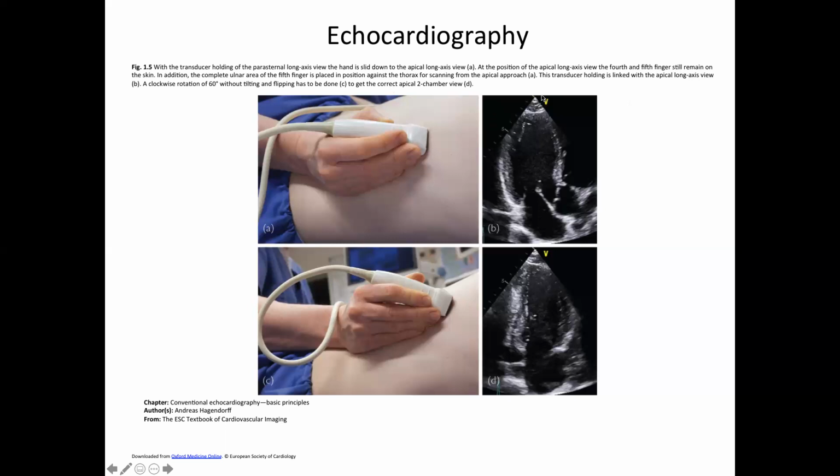And this is the field of view over which that occurs. And here's the location of the transducer, up here. We're going to beam ultrasound energy down into the patient, and it'll reflect off surfaces back here. We'll see this in detail.